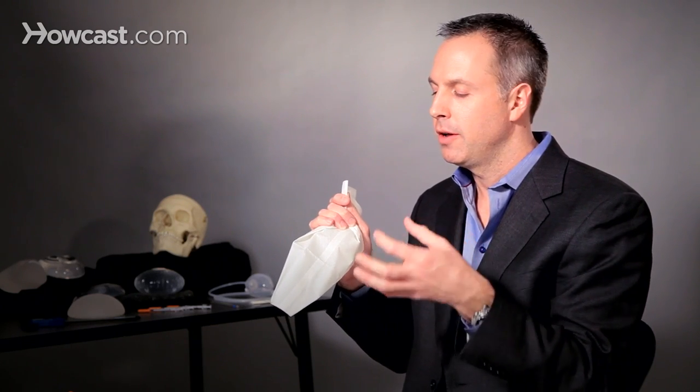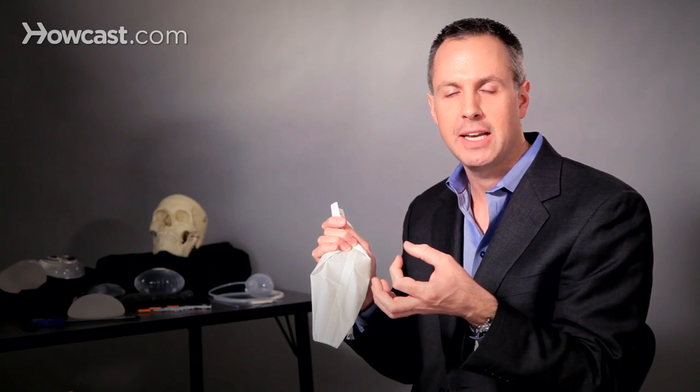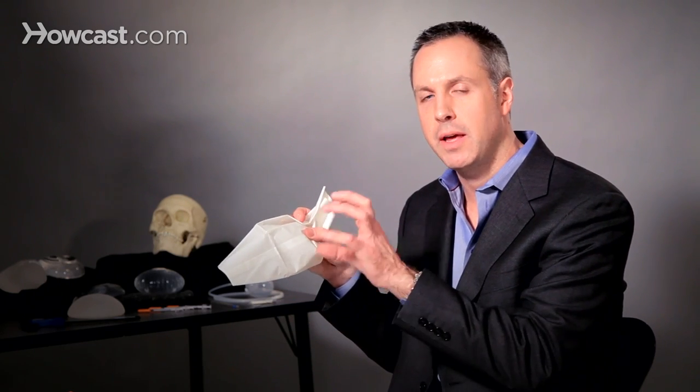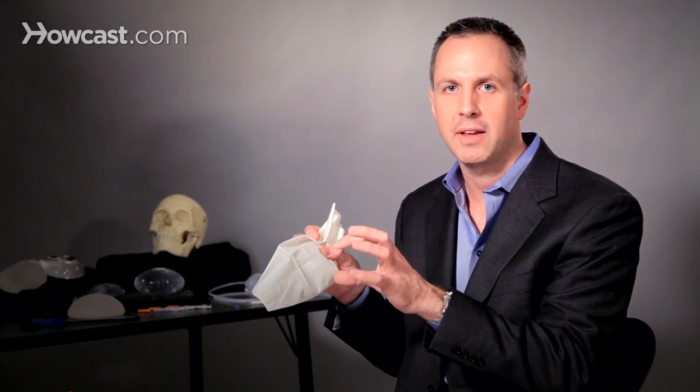So, this is the no-touch technique. It involves touching the implant as little as possible and using a funnel device in order to propel the implant quickly into the breast pocket without contacting the skin.